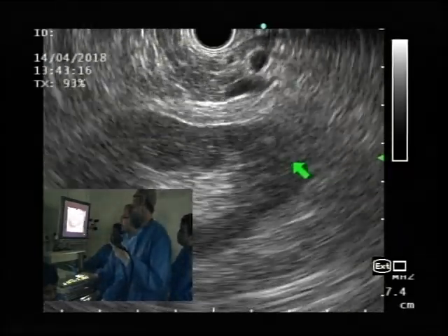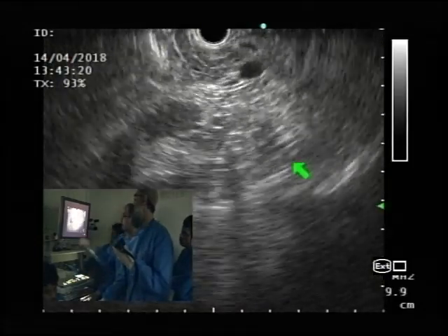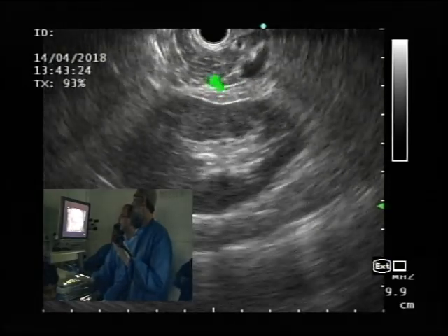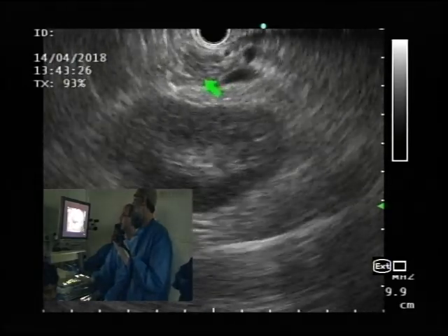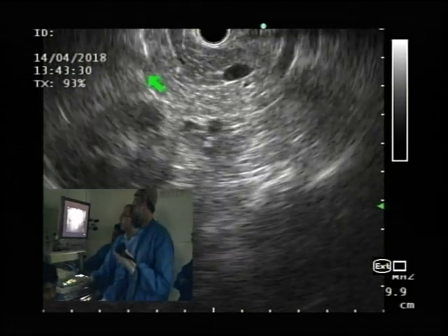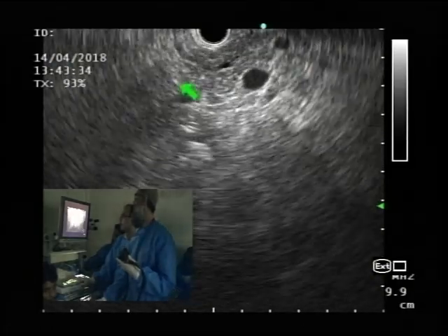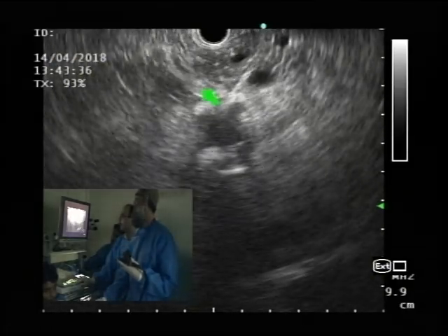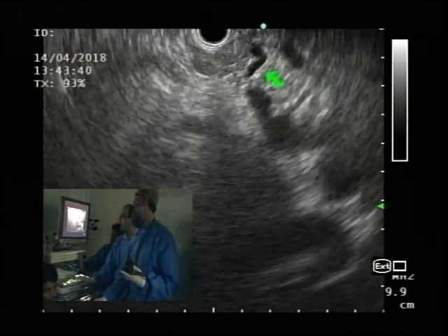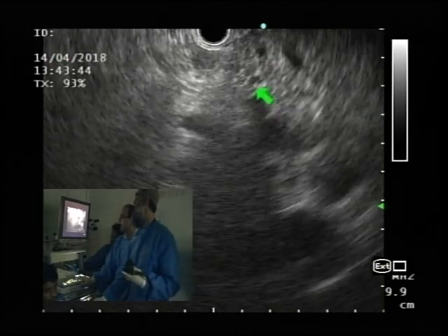Follow your pancreatic duct. I'm going to just for 1 minute actually go down because I want to see what goes on here. So this is your pancreas, that's your kidney. Now go counter, so you're going towards the head and neck. So there's PD coming up, slightly dilated duct, minimally prominent. Again, splenic artery, splenic vein, and there's the pancreatic duct dipping down towards the head.